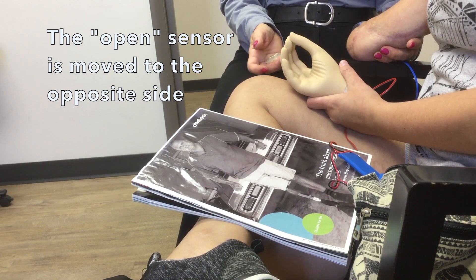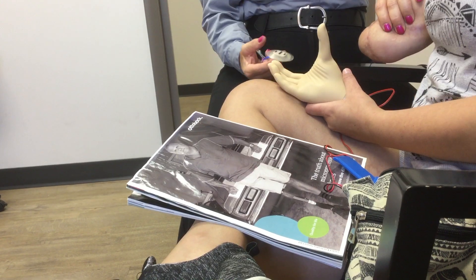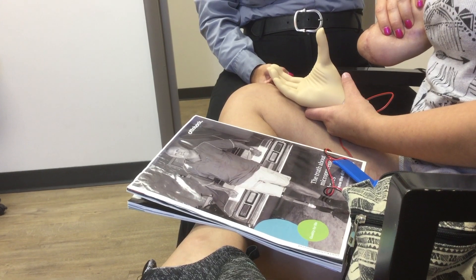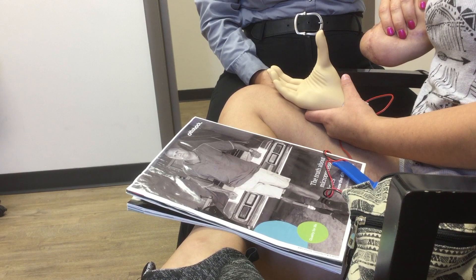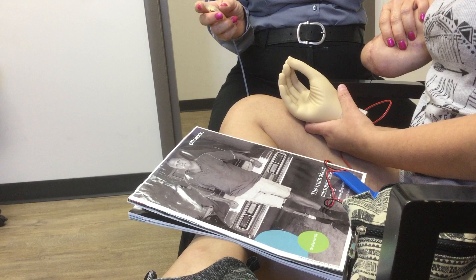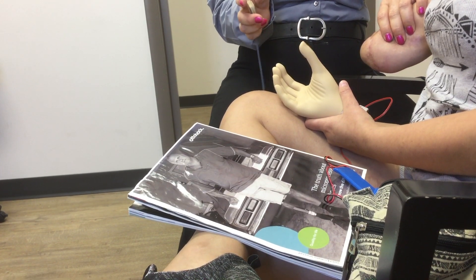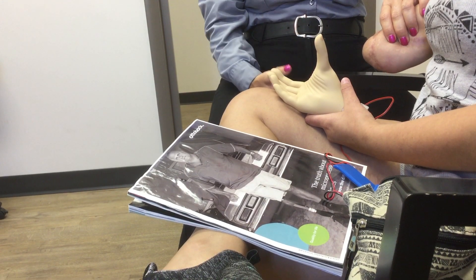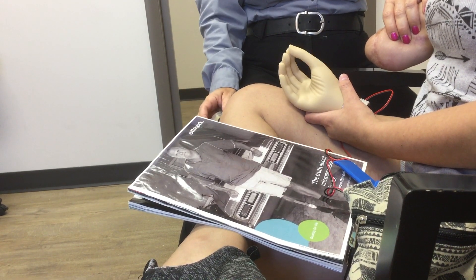You see how little your twitch is right now? Yeah, this side is tricky. In the worst case scenario if we have to do a single site, we just switch. How does that work then? I take one electrode out — so just one movement would open it. If we put the electrode on the outside lateral side of your arm and you just hold it, that will keep the hand open. Once you start to relax, the hand will start to close. It's nice to have the dual because you have better control.